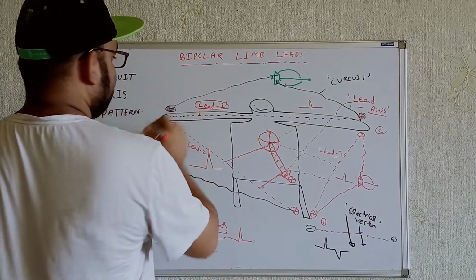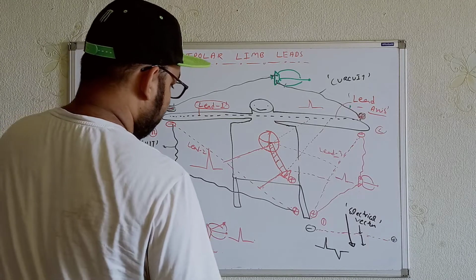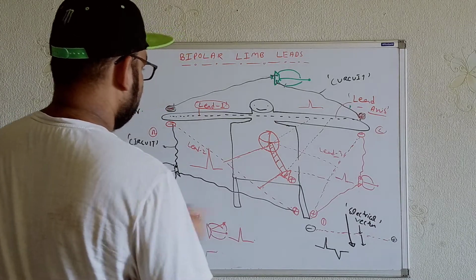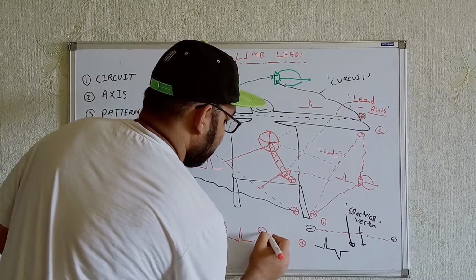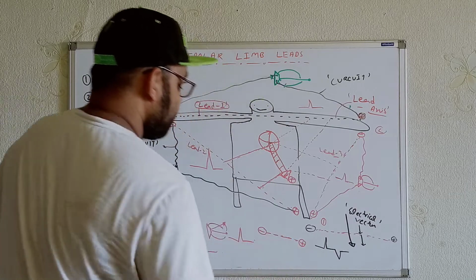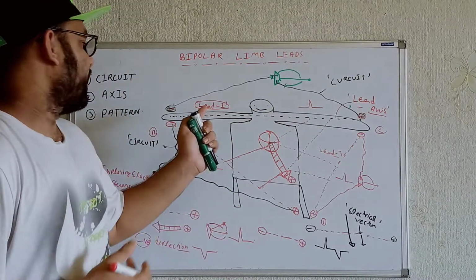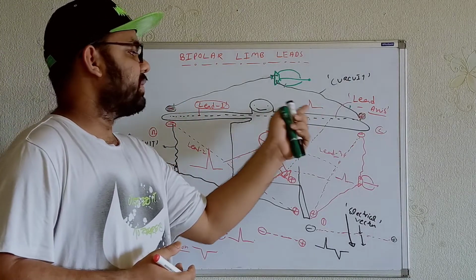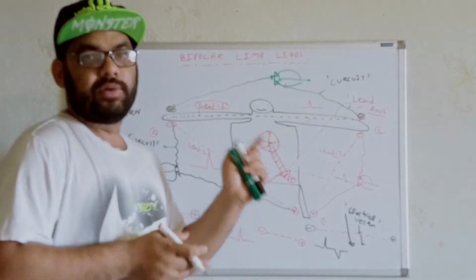Now see, for example, let me show over here. Basically, here is the negative one and the positive one, whenever we are adding the leads on these sides. So basically you are just measuring the potential difference. When you are using the leads with the positive electrode and the negative electrode, you are measuring the potential difference between these 2 points.